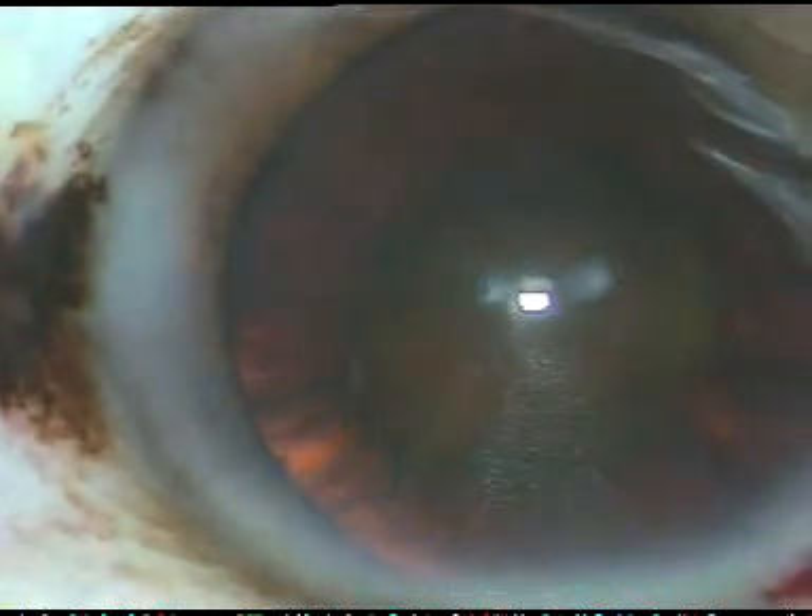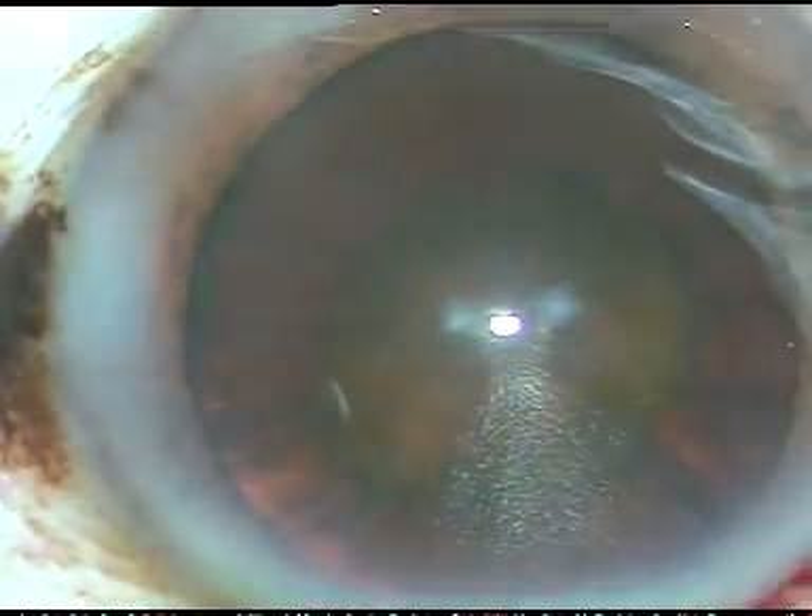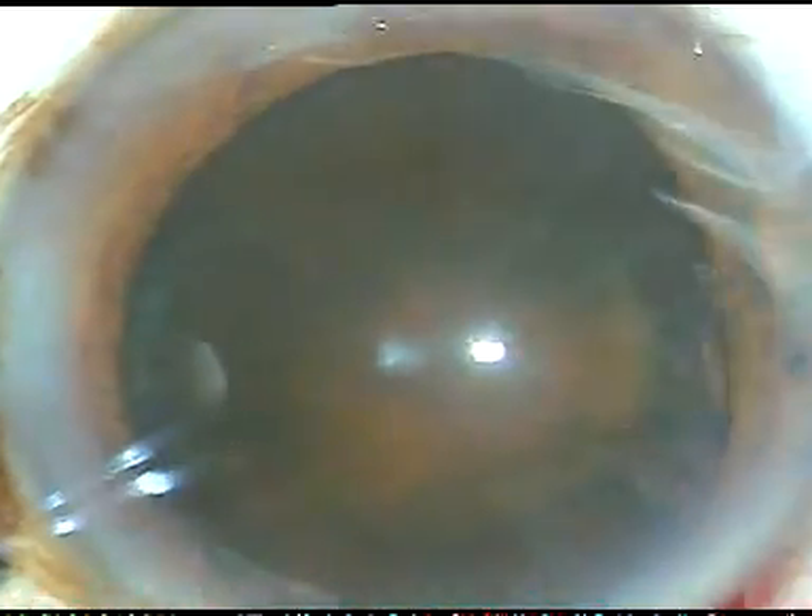Dear colleagues, this is a posterior polar cataract along with a hard brown nucleus. Let me show you how I managed this case.